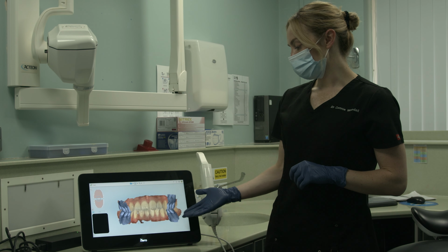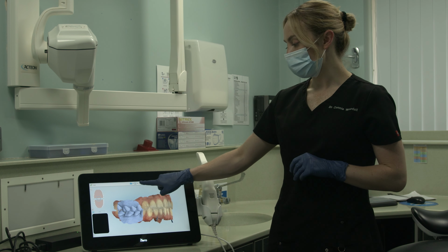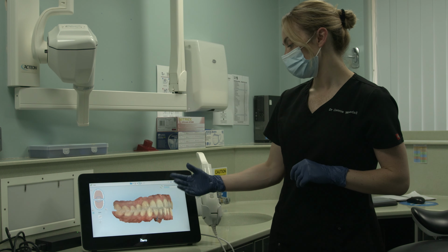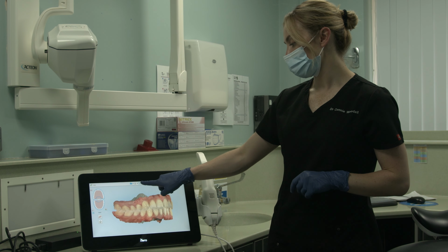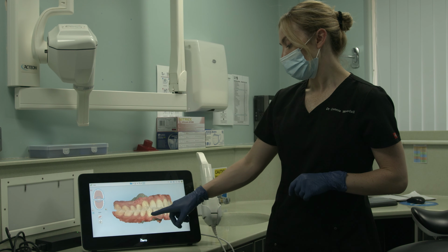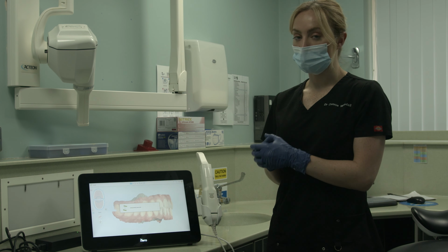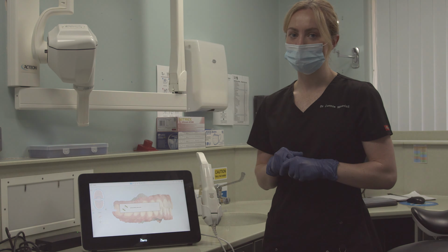So we now have a scan of the top and bottom teeth and also the bite. If you then just click the next button at the top, we'll then process the scan, and once it's been processed, if you click the envelope here, you can then confirm and send, and this will send the scan off if you want to use it on your Invisalign doctor site.